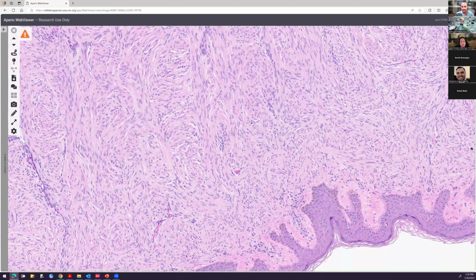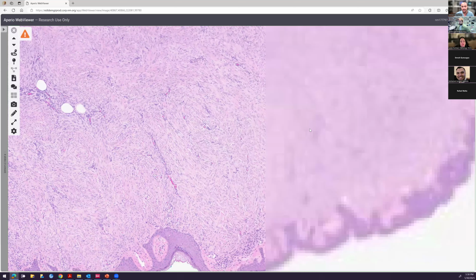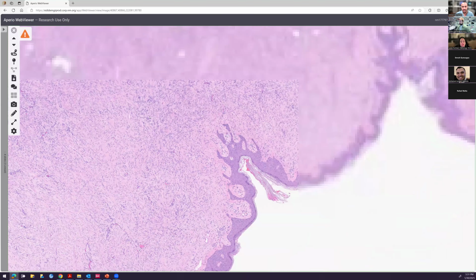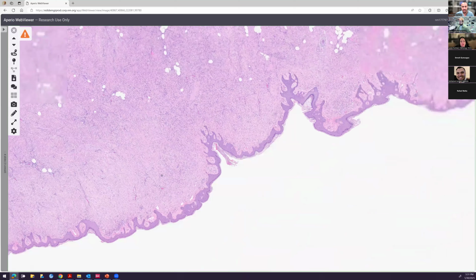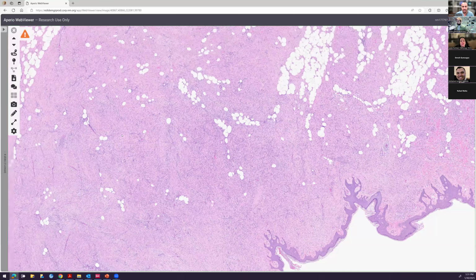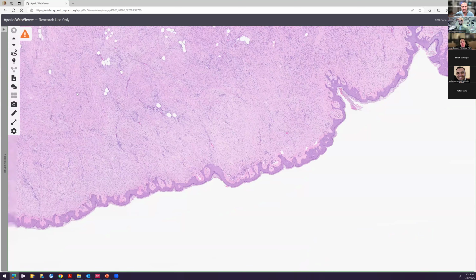where it'll have a lot of storiform and whorling. That's fairly typical. Towards the edges, it may be somewhat infiltrative around the dermal collagen, where it'll wrap around the dermal collagen, but it generally won't have that subcutaneous extension where it'll be septally infiltrating into the subcutis like DFSP does. And then usually the overlying epidermis is quite hyperplastic, actually. All right, well, that's good.